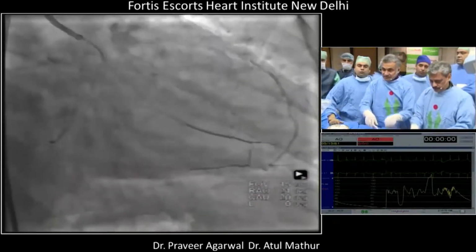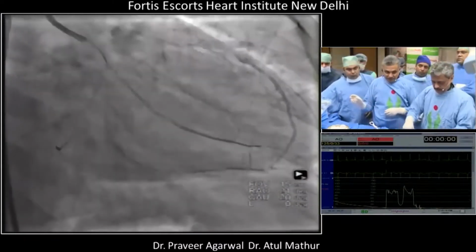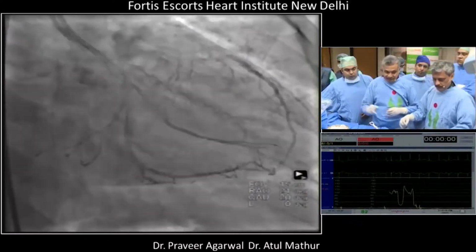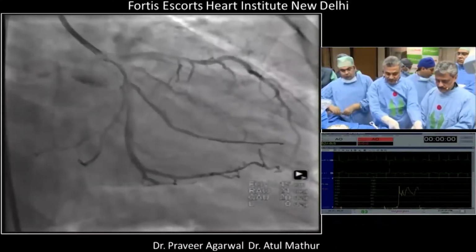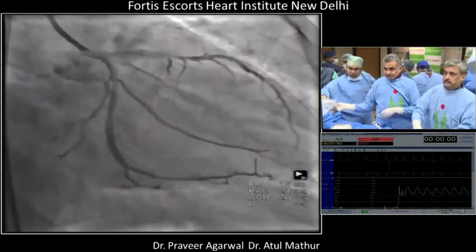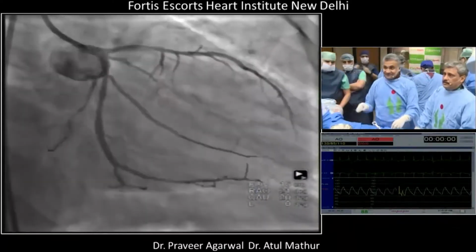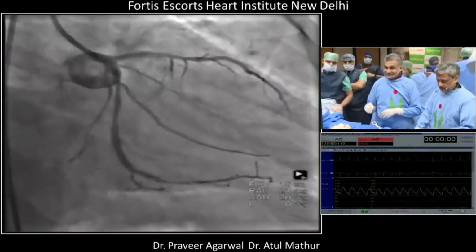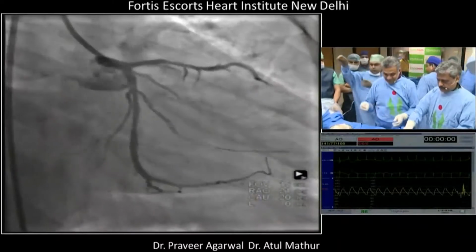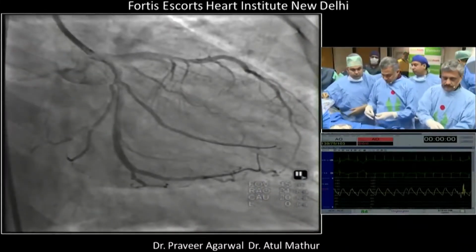Once you dilate such bifurcation lesions, I think there's a lot of plaque burden. It's always good to have good expansion of the stent if you have a cutting balloon there. So you go with the cutting balloon now? If you guys agree. We have a 2.5 cutting balloon first for the side branch. Yeah, I think go ahead. So you can take that. One of the most important things: we'll take a 2.5 cutting balloon in the upper branch.